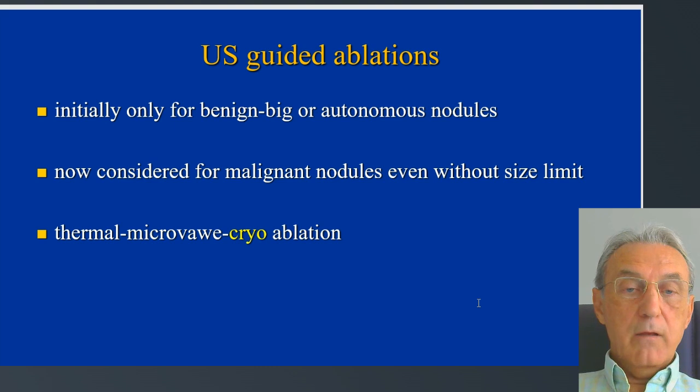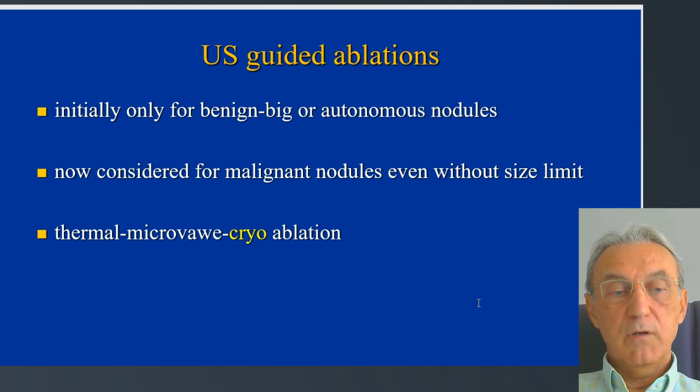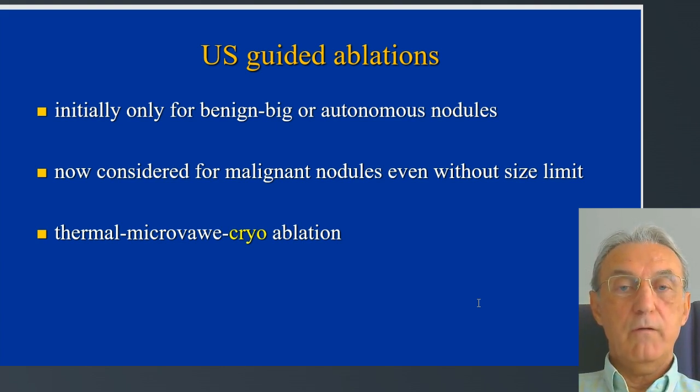Coming to the end of the diagnostic part, I should mention the treatment part also, because ultrasound is also very valuable in guiding ablations of the thyroid nodules, even if they are cancer. Initially, ultrasound guided ablations were applied for benign, big, or autonomous nodules.